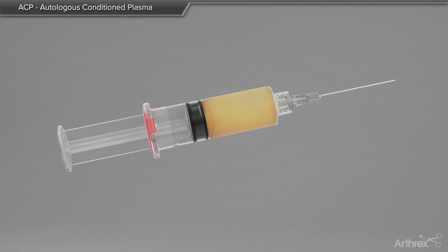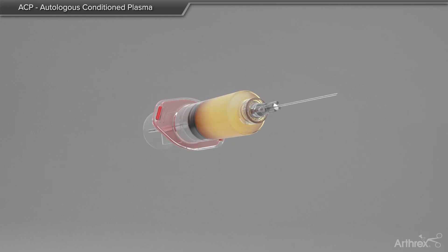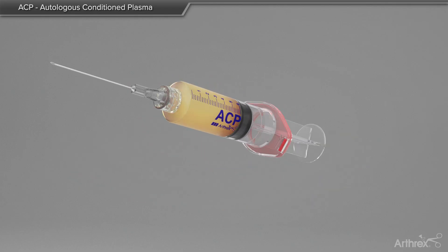Autologous conditioned plasma, also known as ACP, is a technology that isolates platelets and growth factors within a plasma layer, separate from the red and white blood cells in the blood.